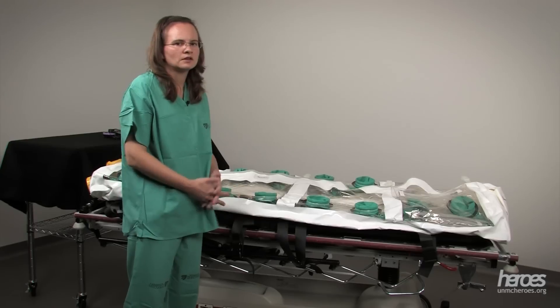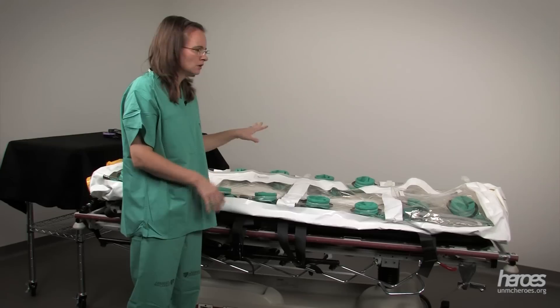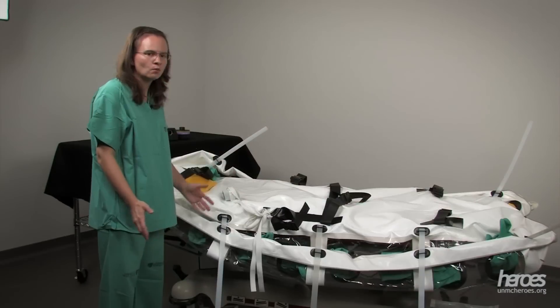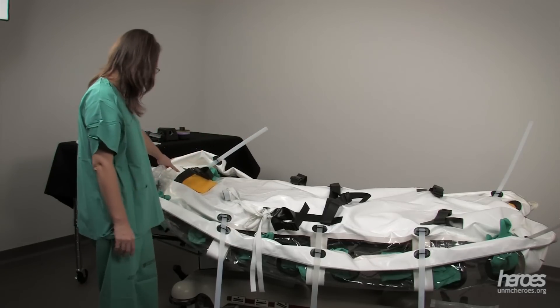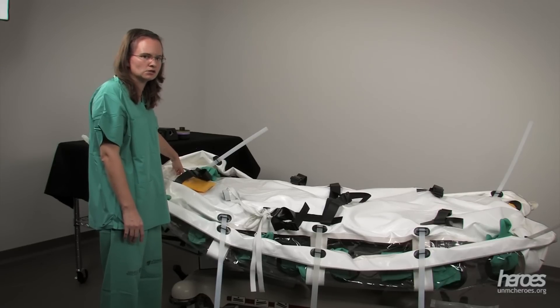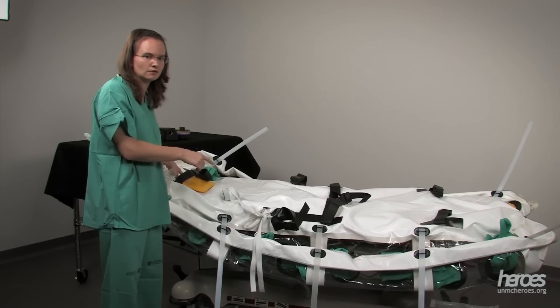There may be situations with an ambulance gurney where it would be better to use the belts connected to the gurney to hold the isopod on safely and stably. Once you open the isopod, you're going to notice that there are several straps inside. Another thing you'll see is this yellow head pad — that indicates where the head of the patient should go. So make sure that the head of the isopod lines up with the head of your cart.